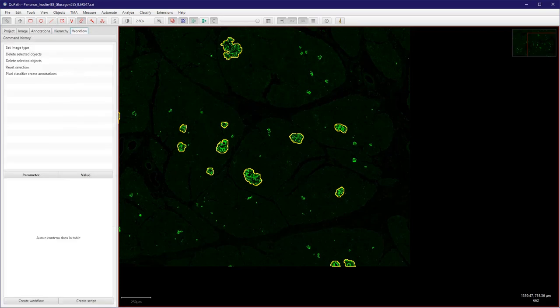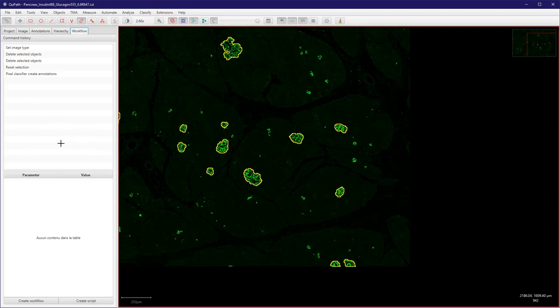At the workflow, so we can see that we use the pixel classifier to create some annotations. This is a step that can be automated, and just for the fun of it, let's add a cell detection step.